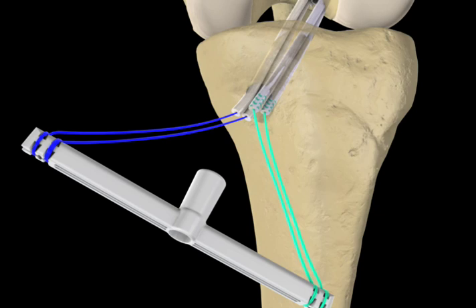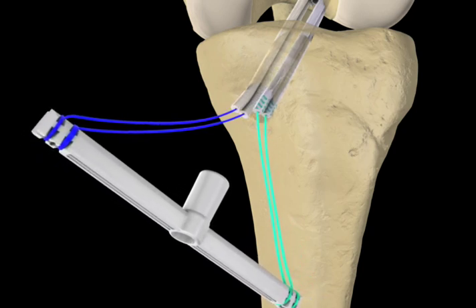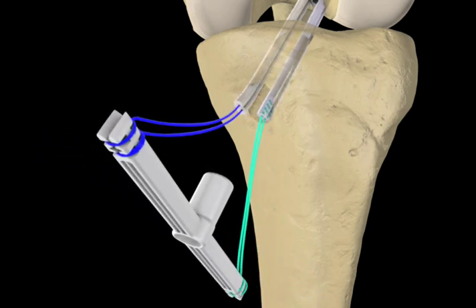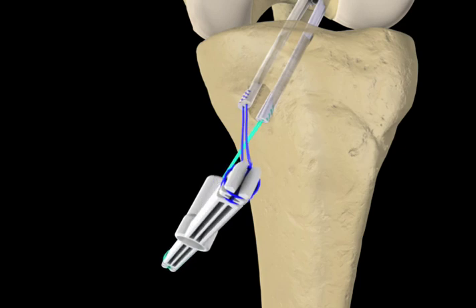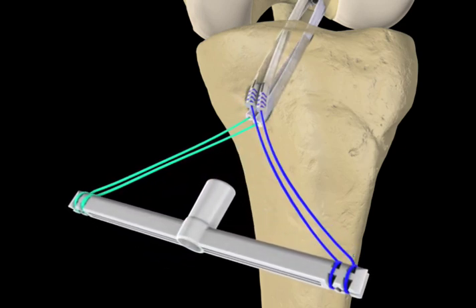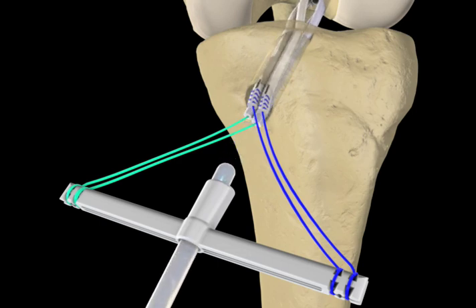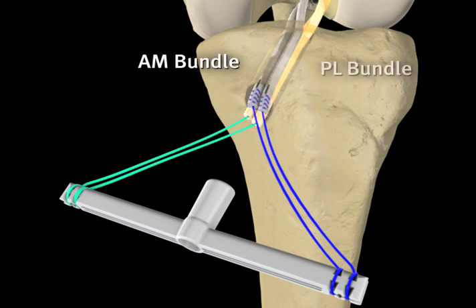For proper orientation of both graft bundles at the tibial aperture, rotate the tendon expander until the tendons representing the AM bundle are positioned in the anteromedial portion of the tunnel and the PL bundle in the posterolateral portion. Positioning can be facilitated by inserting a flat device, such as a freer elevator, into the tibial tunnel between the bundles to rotate the graft at the internal aperture.